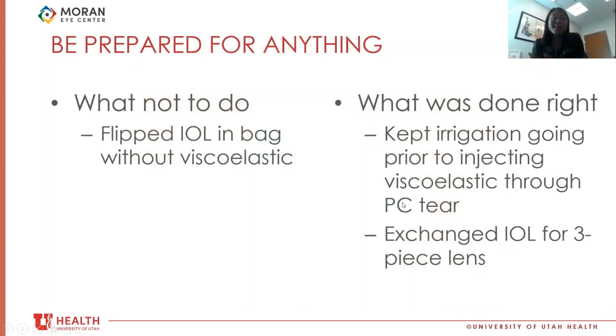So be prepared for anything. This is the first and only time, knock on wood, that I've had an IOL flip like that, especially after it had been in the eye for several seconds and was starting to unfold in a good way. It wasn't in a very tight scroll. So what I think I should have done in retrospect was not try to flip the IOL while it was in the bag without adding any viscoelastic.